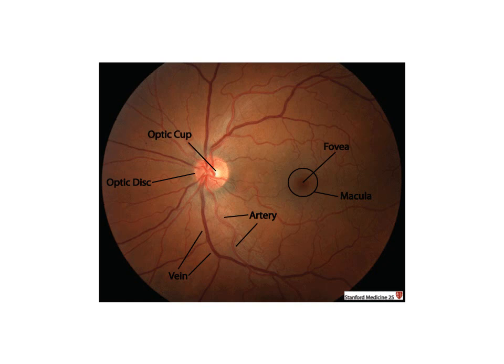Firstly, the optic disc, and you examine the optic cup. Then you have to examine the macula, which is around 2 disc diameters away from the temporal edge of the optic disc, and there is a bright spot by name fovea centralis in the middle of the macula, which keeps shining as you focus the light on that. That has to be examined, and the artery should be examined, veins should be examined, then the background retina.